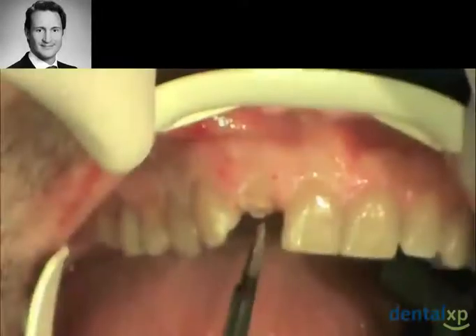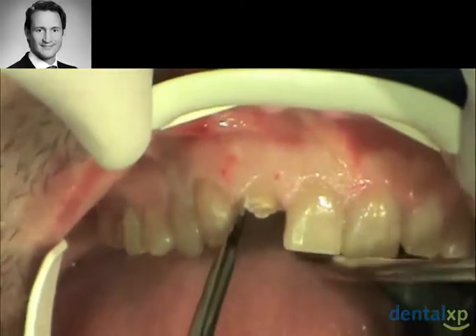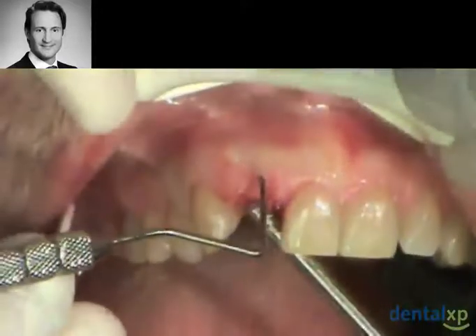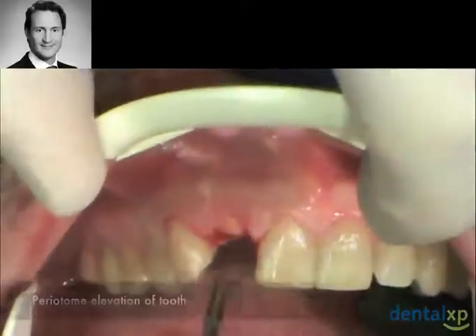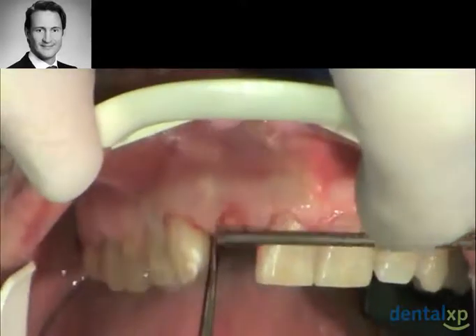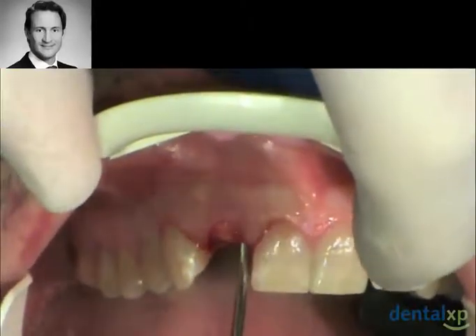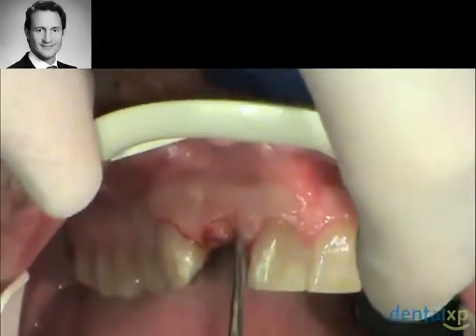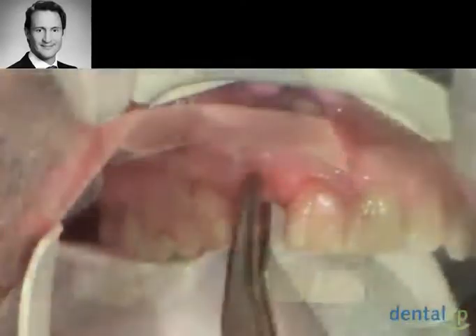Initially, after anesthesia is obtained, a number 15 blade is utilized to release the sulcular epithelium. The buccal plate is probed for evaluation, and a periotome is utilized to completely mobilize the retained root segment. This is performed so as to avoid any pressure on the buccal, and the tooth is then easily removed with a forceps.